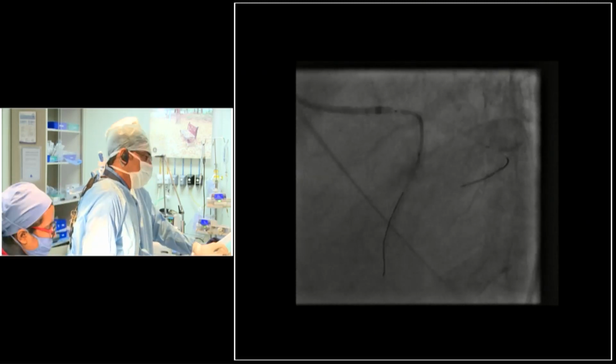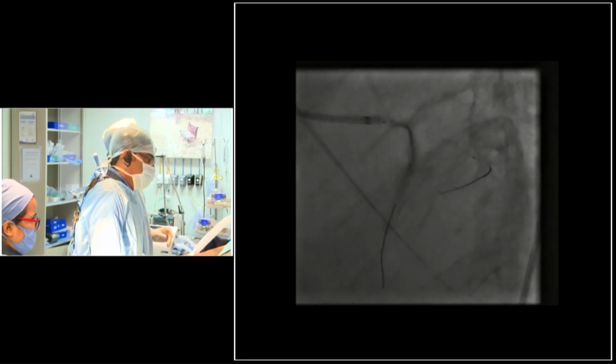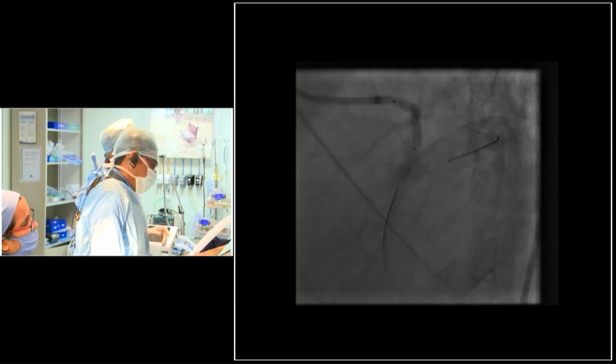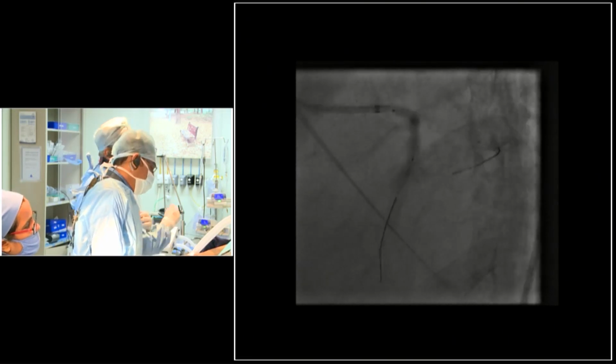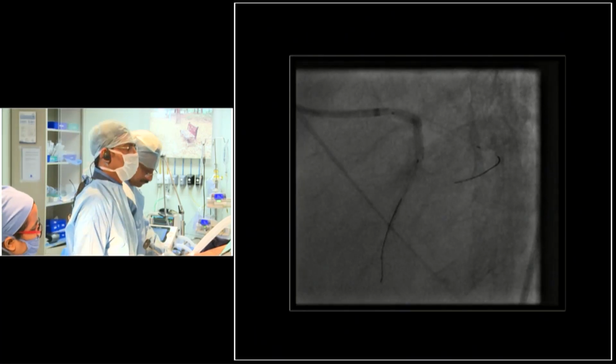Okay, go. That's ready. The most important thing is to not cover the diagonal now. We could have changed the stent, but it is okay. I think we can just... Hey, Bhubadi, what do you think? It is expanded reasonably, right? Other view back. Yes, sir, definitely it has expanded well.